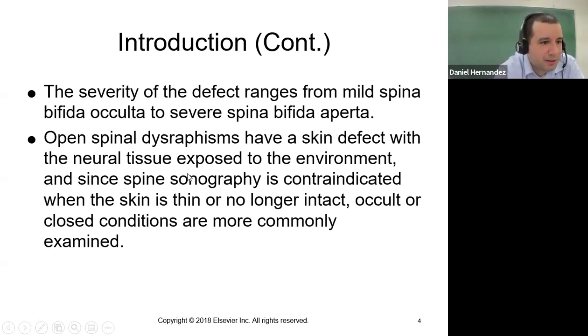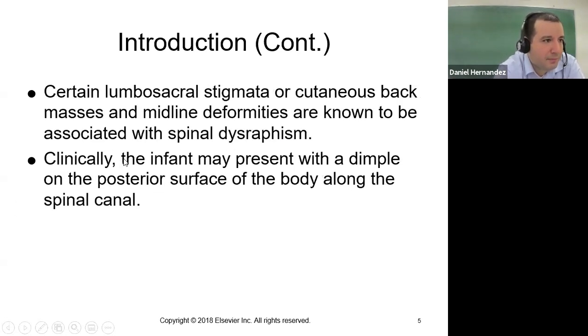Since spine sonography is contraindicated when skin is thin or no longer intact, occult or closed conditions are more commonly examined. Certain lumbosacral stigmata, or signs, or cutaneous back masses or midline deformities are known to be associated with spinal dysraphism. Most commonly, that's going to be your sacral dimple.